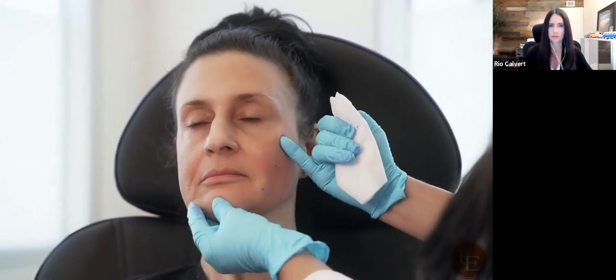We can expect a little bit of bruising as the face is very vascular, but over time this whole area is going to get thicker and thicker. She'll come back and reassess again in a couple of months.